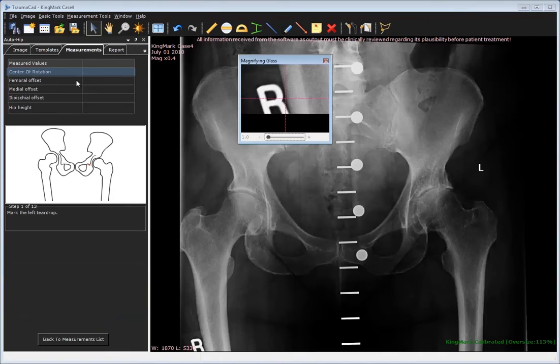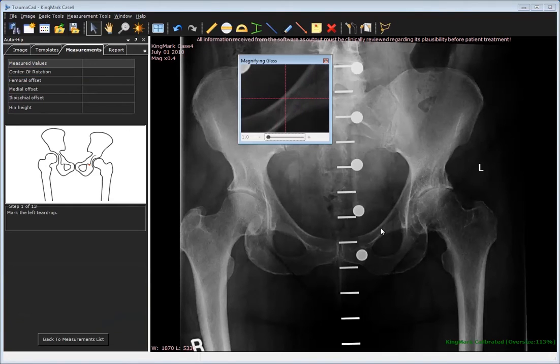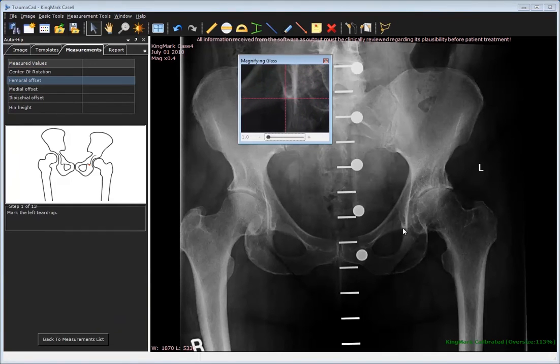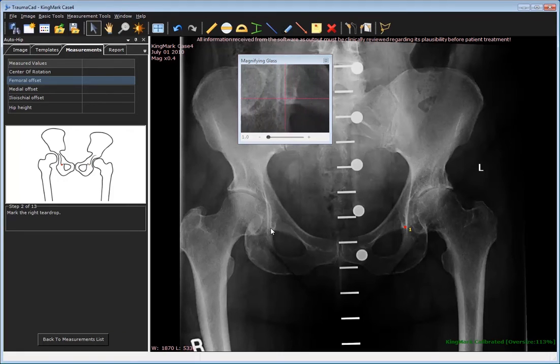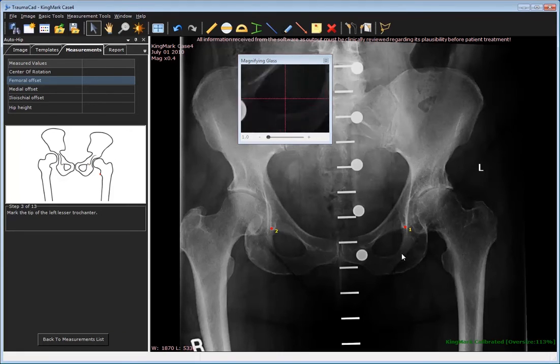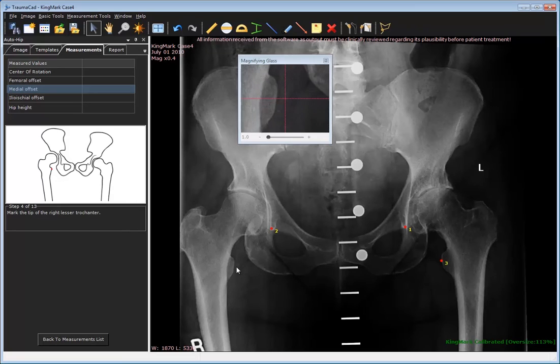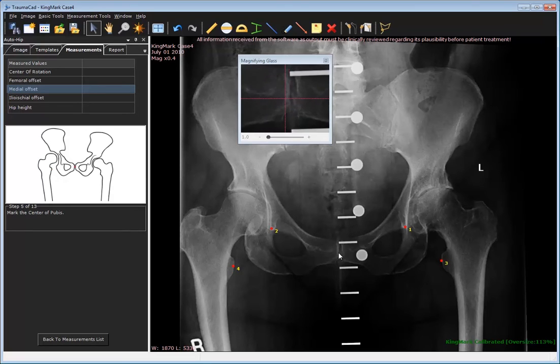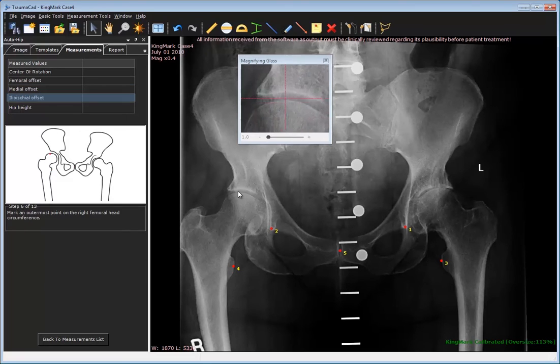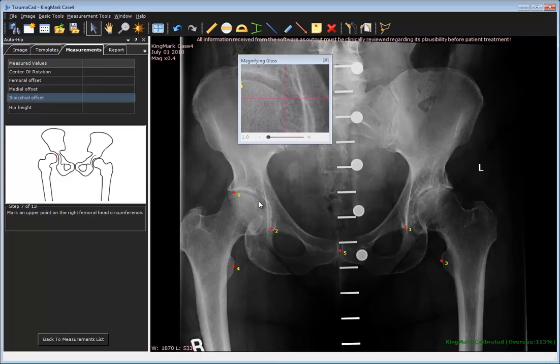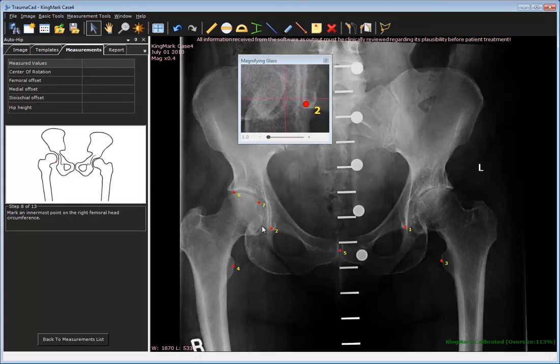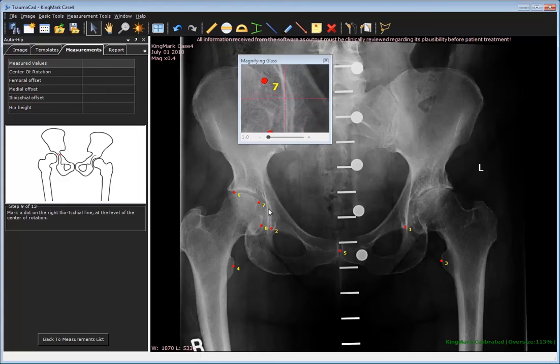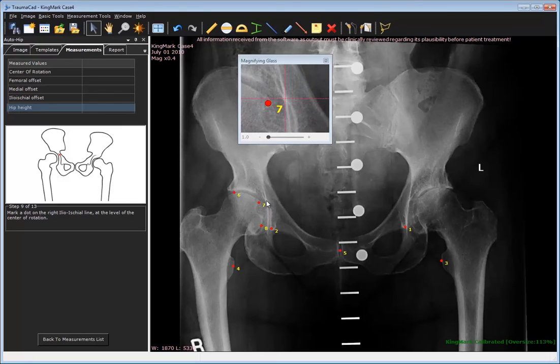When all steps of the wizard have been completed, the following measurements are given: center of rotation — the measurement between the center of the head and the reference Hilgenreiner's line; femoral offset — the deviation of the center of the head from the axis of the femur; medial offset — the measurement between the center of the head and the center of the pelvis; and ilio-ischial offset — between the center of the head and the ilio-ischial line at the level of the center of the head.